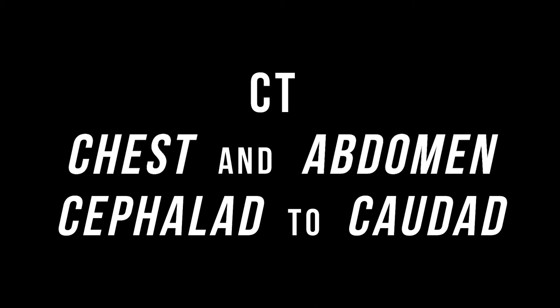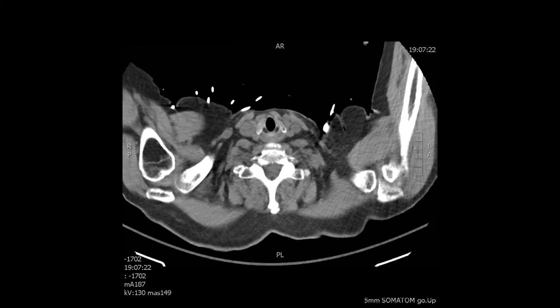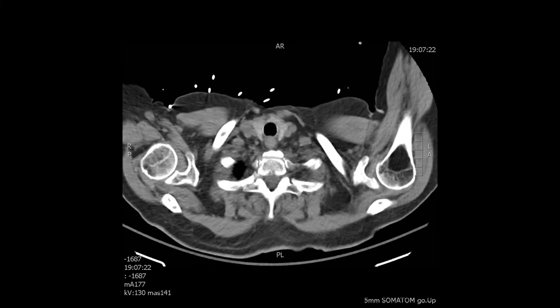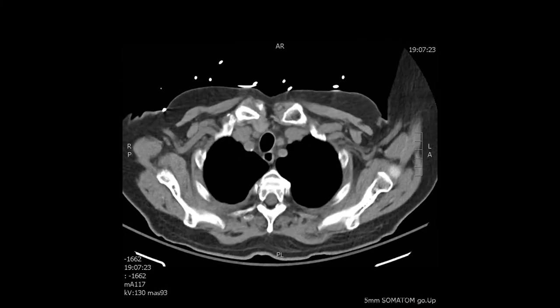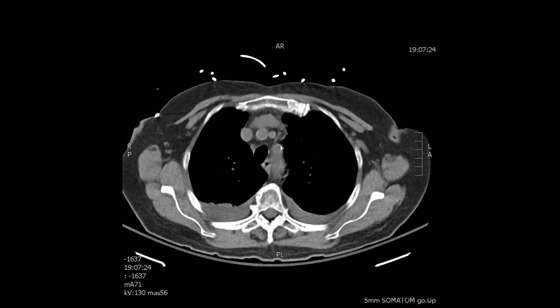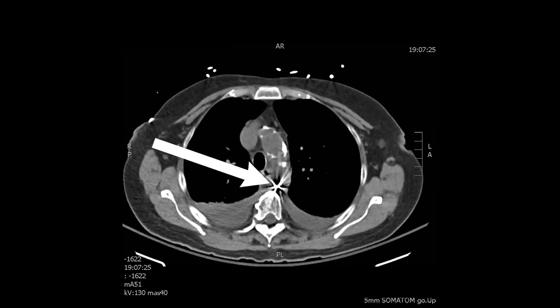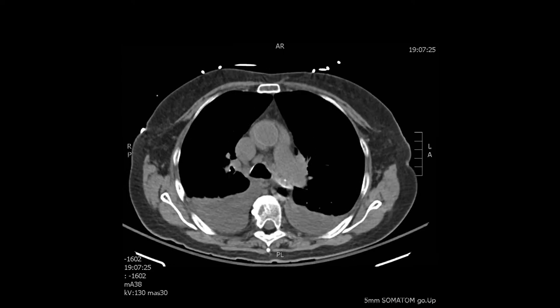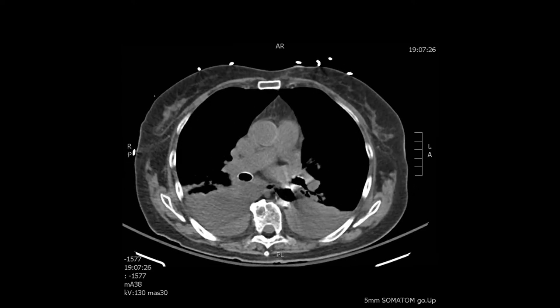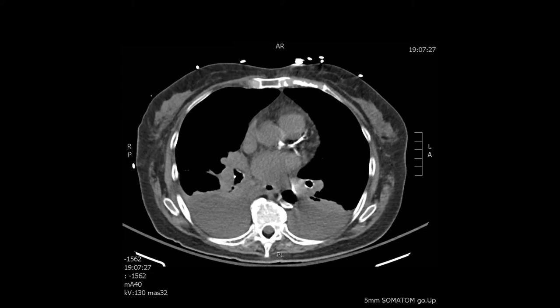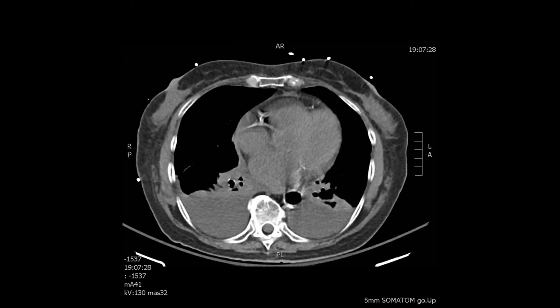We're going to review the CT chest and abdomen from cephalad to caudad. The CT of the chest was combined with the abdominal one, and here we go from top to bottom. You can see the aortic arch and the top marker of the balloon pump. As you go down, you see the aorta entirely in black, as the balloon pump was caught in an inflated phase in this patient.